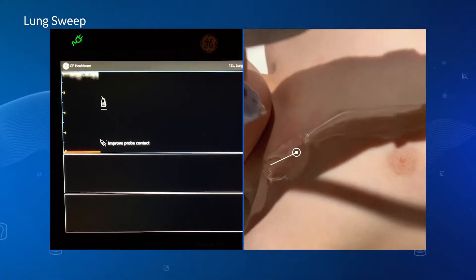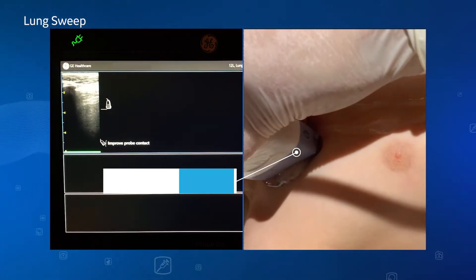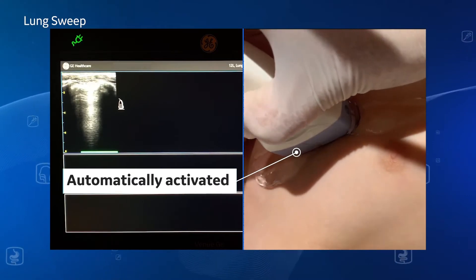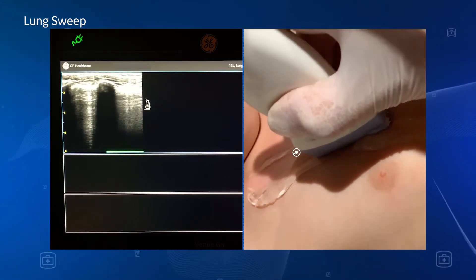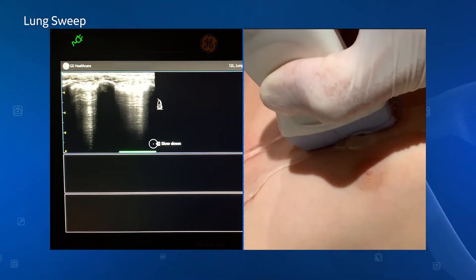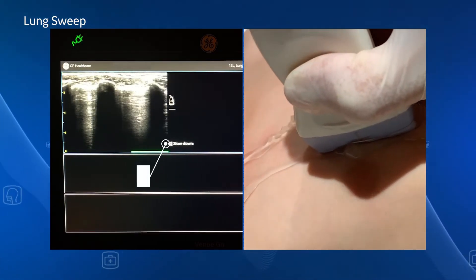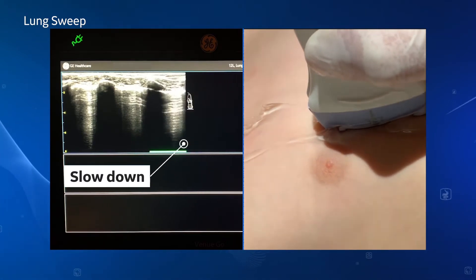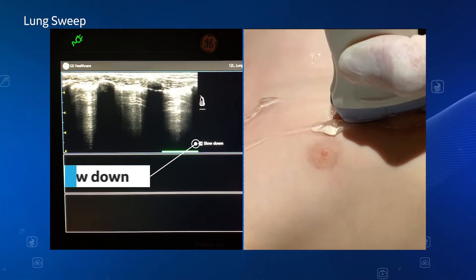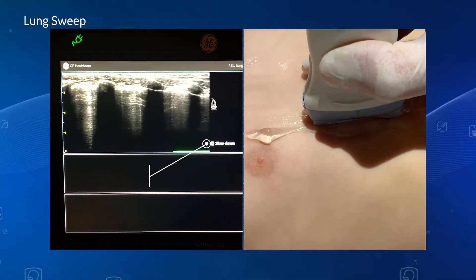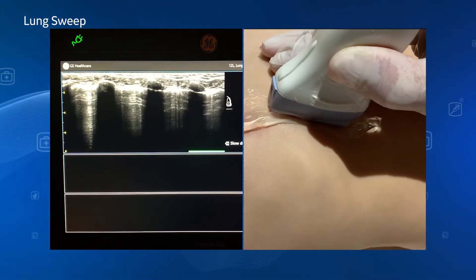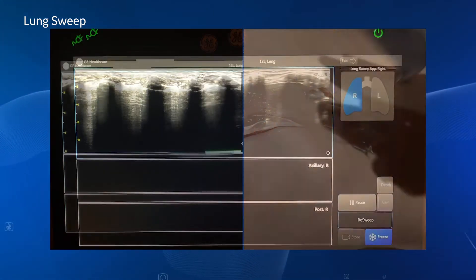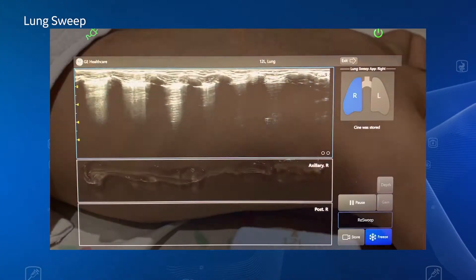Lung Sweep is automatically activated when the probe is tapped on the body. If the user is sweeping too fast, you'll see a message to slow down. Lung Sweep is deactivated at the end of each sweep when the probe is lifted.